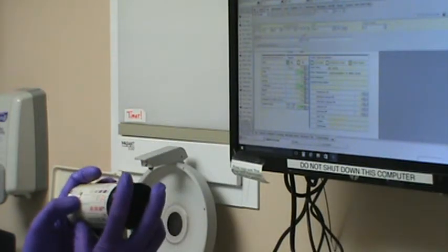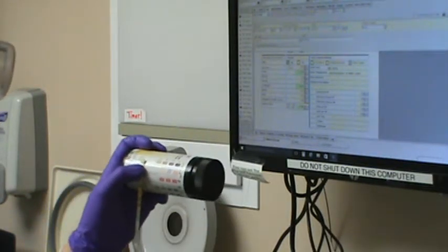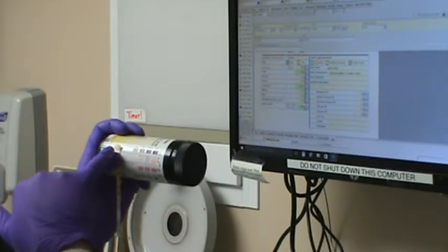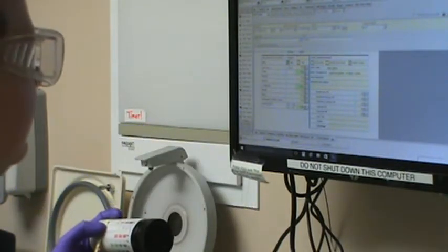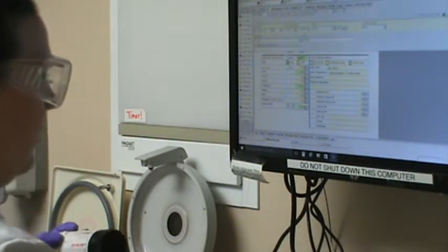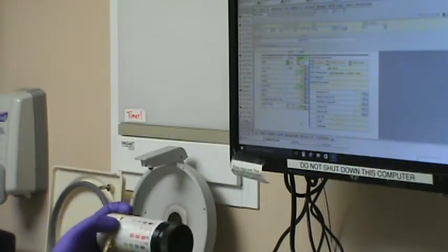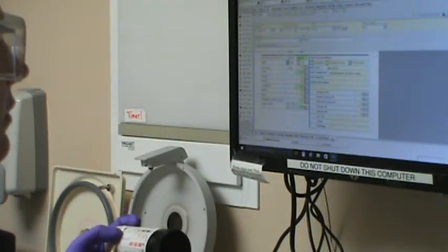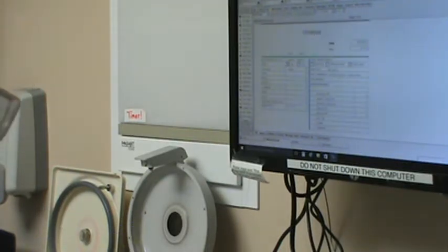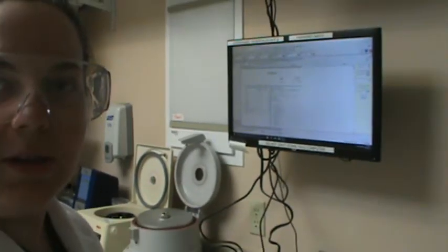And then last but not least, we have our leukocytes in the urine test that we generally do on dogs only. There's no color noted, so that's going to be negative. So up here, we're just going to say negative. All right, so we have all of our information in here. We're going to go ahead and save that, and exit, so that it saves in the record. I'm just going to place this down, and then we're just going to zoom back out.